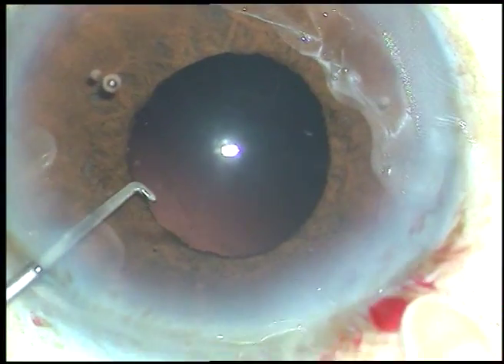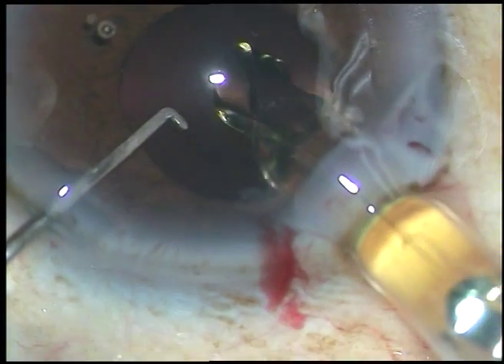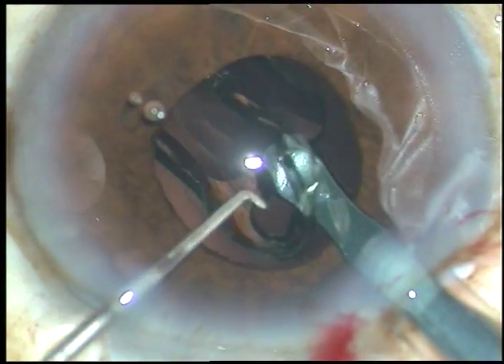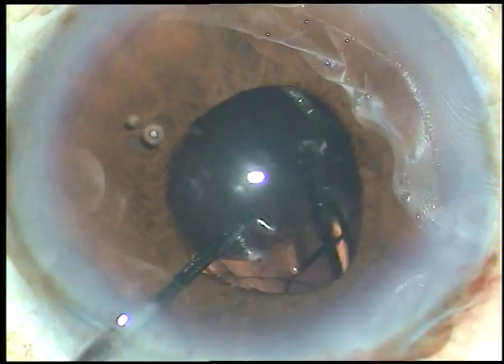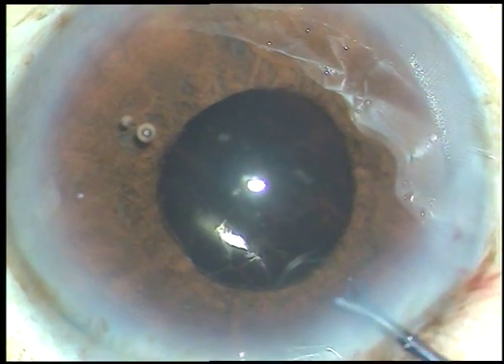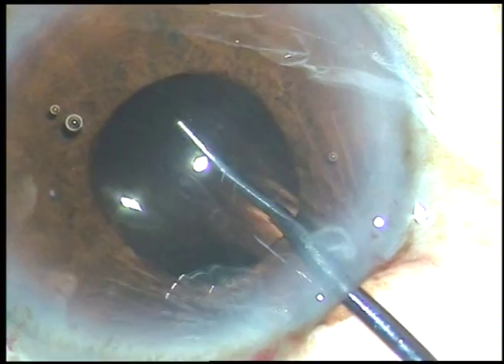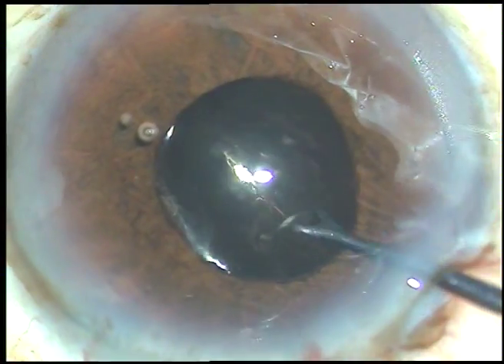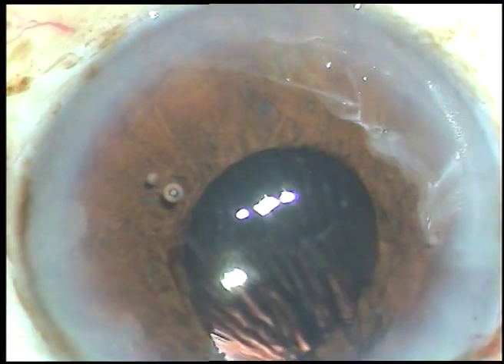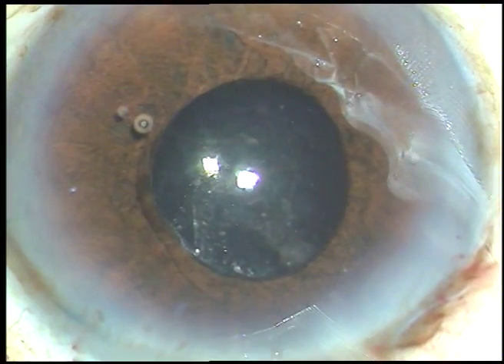There is no cortex anywhere. So I am implanting an intraocular lens — this is a hydrophobic acrylic intraocular lens. The lens has gone into the capsular bag, but still I am having a check to confirm that it has gone into the capsular bag. Yes, it has gone into the capsular bag.